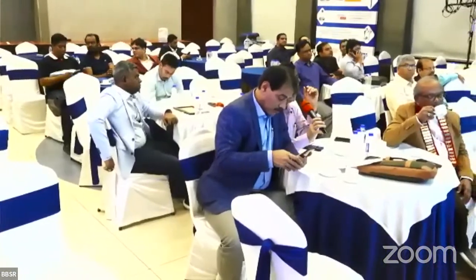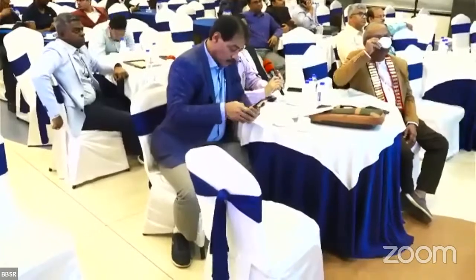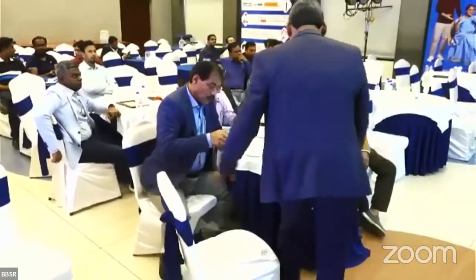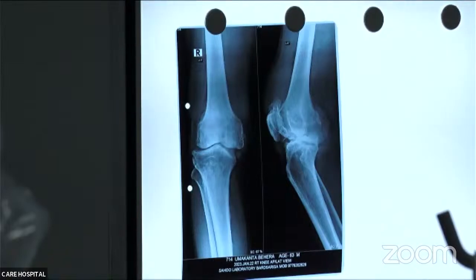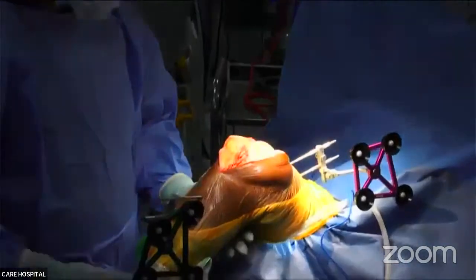Okay, so he's a 63-year-old patient with varus deformity. And if you can see the X-ray, there is a posteromedial defect. Now, let me show you the patient's clinical picture. So we have opened up the joint. Can you focus on the knee? We have opened up the joint by medial parapatellar approach.